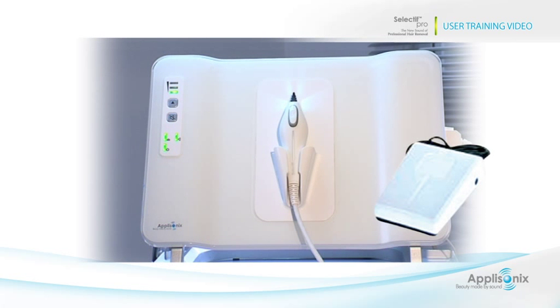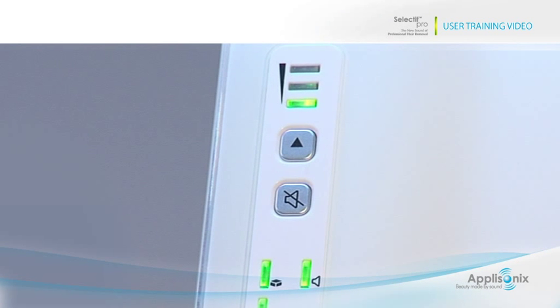Let's get acquainted with the different parts of the system. At the top of the panel, we have three green mode indication lights which indicate the selected mode of operation. We will go over the modes in the next section of the video. Right beneath the mode indication lights, we have the mode selection button and the mute button.